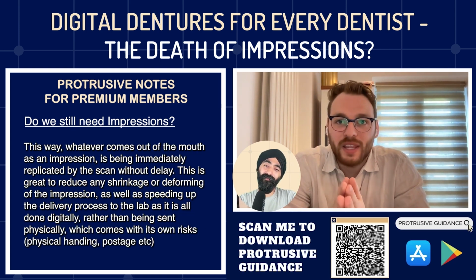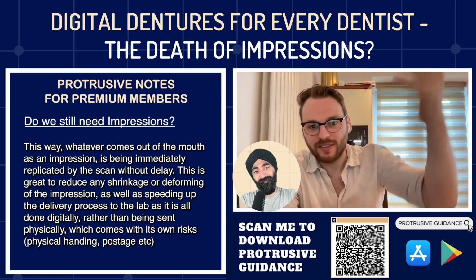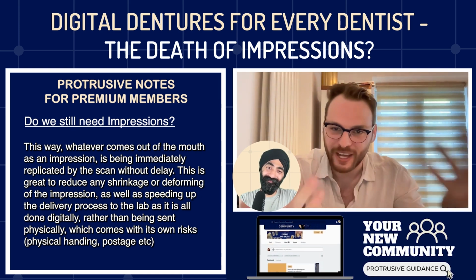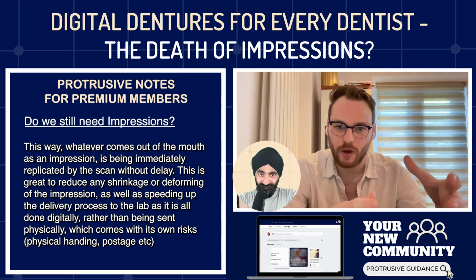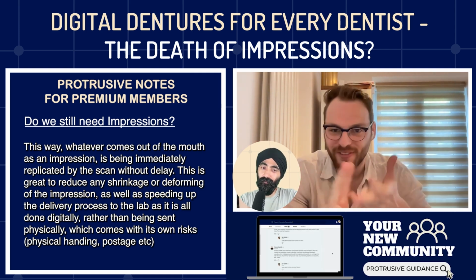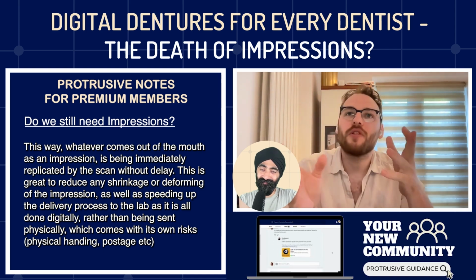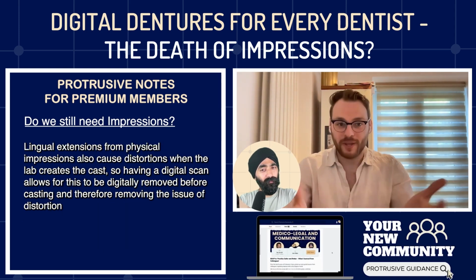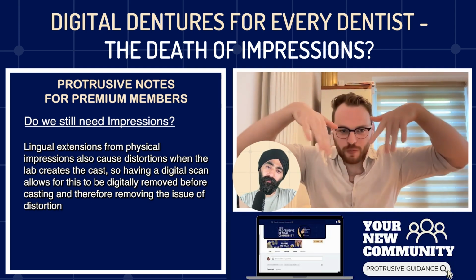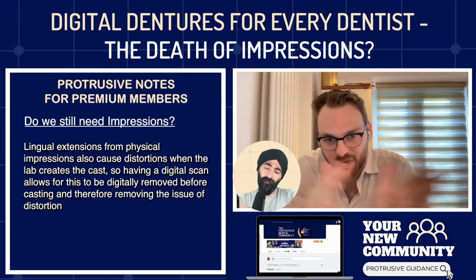The benefits of doing that. My technician Dean is up in Oldham. You know, I'm not posting it overnight. It's not in this hot weather being left on top of a radiator or something. The bag opens, the alginate dries out. Whatever comes out of the mouth is being replicated by the scan. There's infection control stuff, you know. You're not worried about did the nurse completely perfectly disinfect that thing that my technician's going to open, you know. But also things like, you know, we've done those lower, as you mentioned, we talked lower completes 2 episodes ago. You know, we've all done it where we've got that super scraggly bit of lingual extension that's super flappy and moving around.